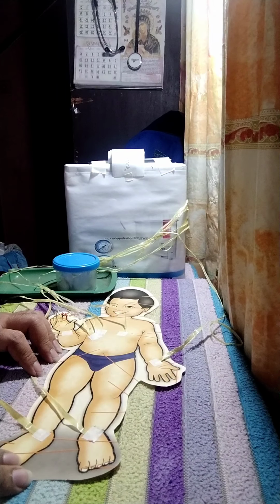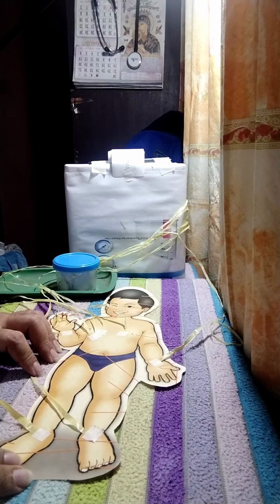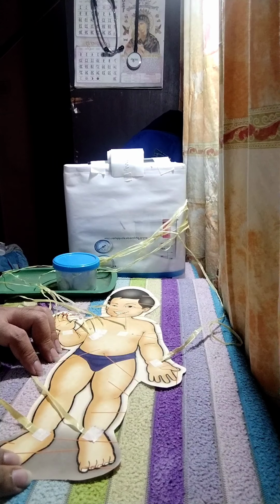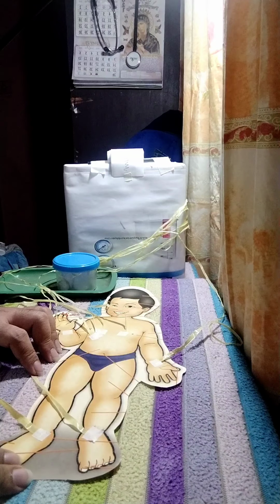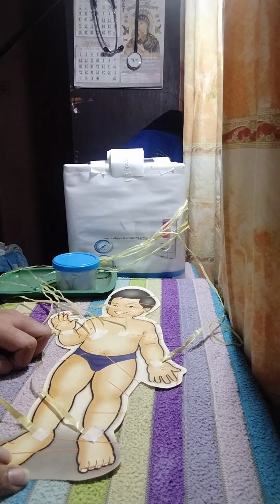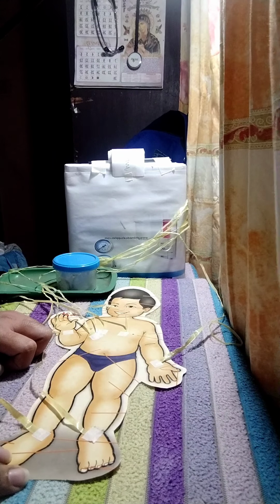Next, ask the patient to relax and breathe normally. Instruct the patient to lie still and not talk while you record the ECG. Sir, could you relax and breathe normally? And you should, sir, lie still and not talk while I record your ECG. Next, press the auto button. Observe the tracing quality.